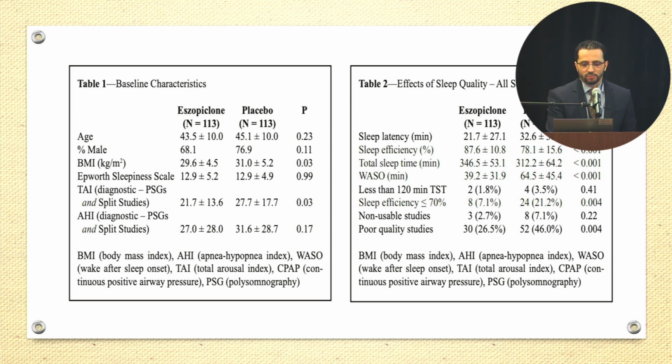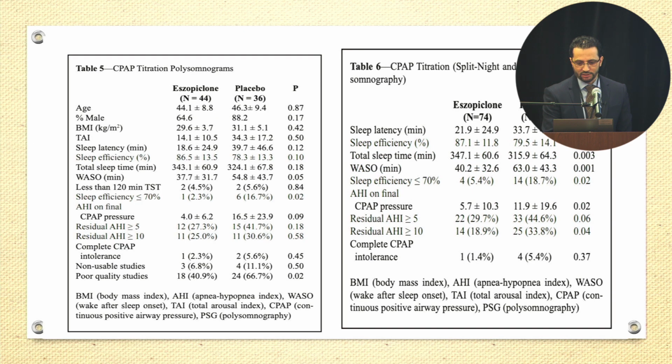So patients slept longer on CPAP. They needed less pressure to titrate to get to a better RDI faster as well, and the quality of sleep was better on the hypnotics.